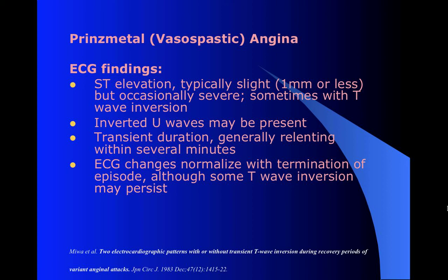Sometimes you'll see some T-wave inversion and it lasts a little while. But if you get in there maybe a few hours after it started, the pain is still going on, you have findings on the EKG that look ischemic, that's not really classic for Prinzmetals.